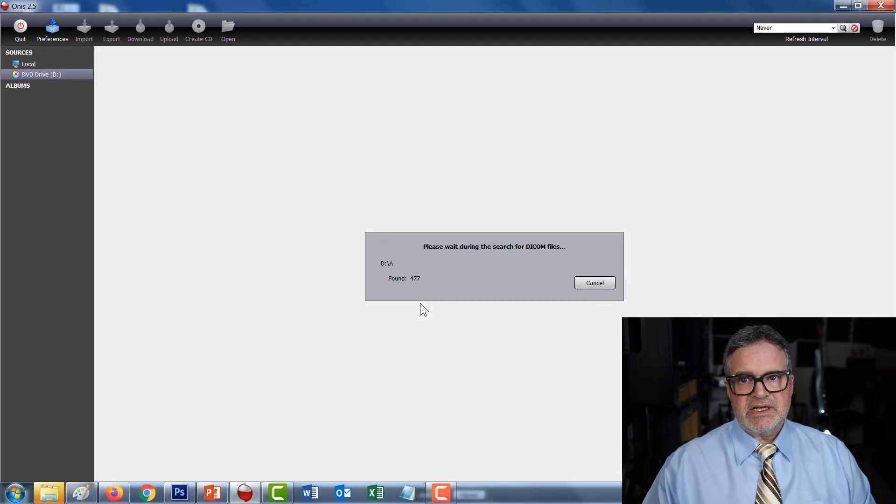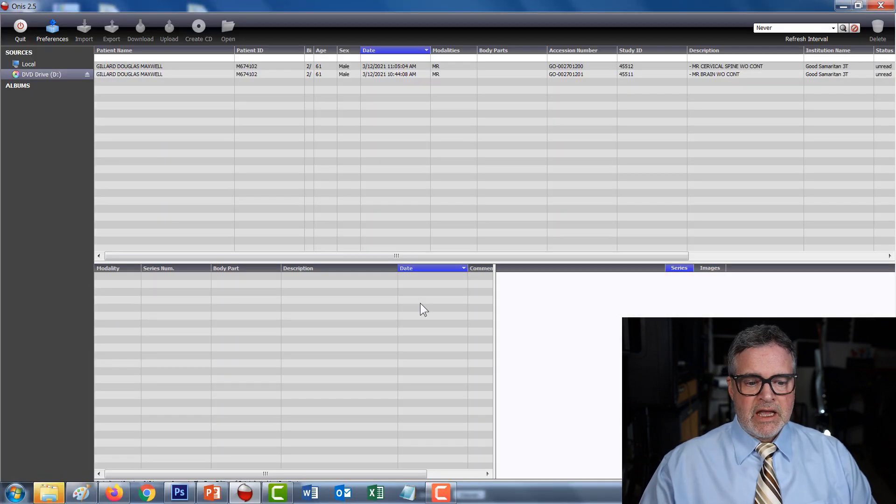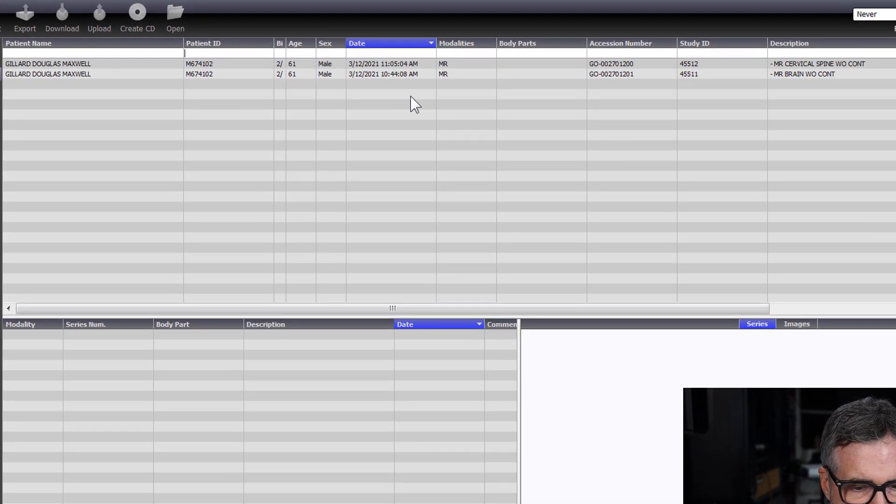I recommend copying all the images off the DVD and putting them in a folder on your hard drive. It runs pretty slow when using the DVD drive — it still works, but it's a slow process. Once it's done, you can see it's loaded two images: a brain MRI and a cervical MRI. That's the one we want.